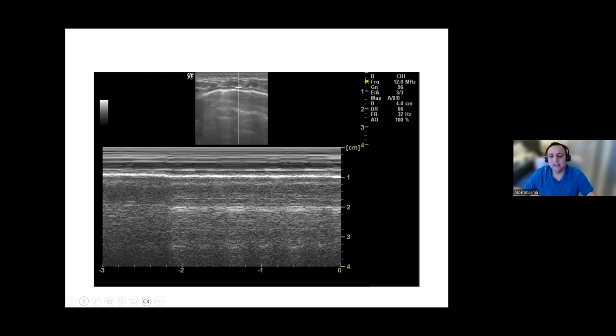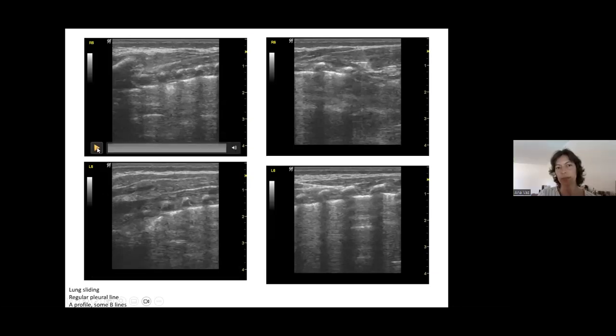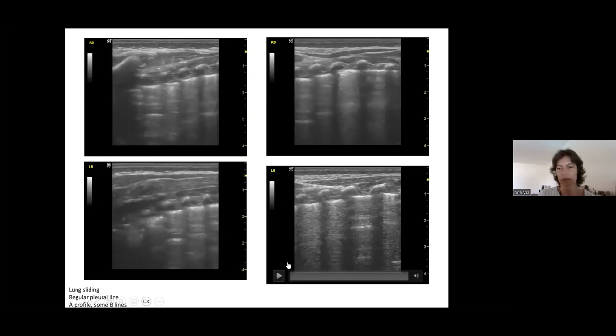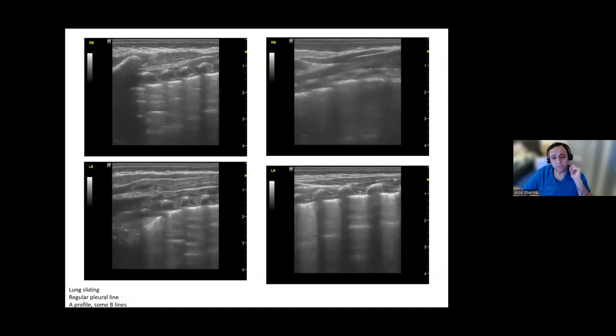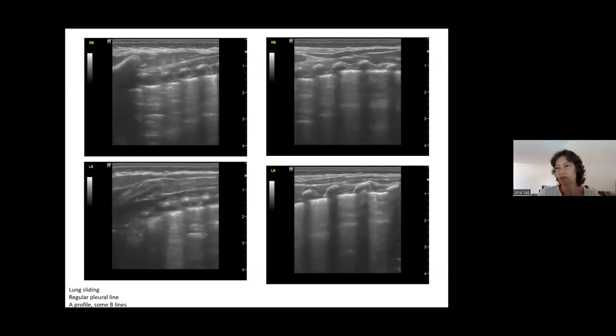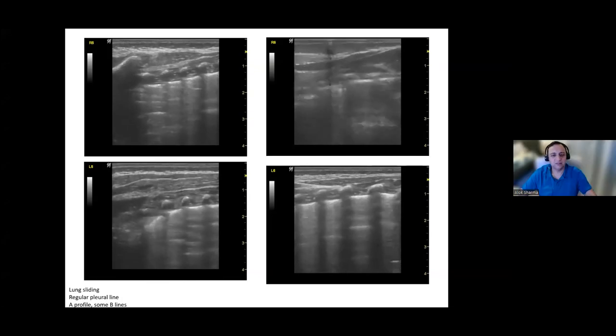I think if the baby ever became symptomatic again with respiratory distress, you'd repeat. But if the baby's clinically better and symptoms are improving, now he's good. Yes. I wouldn't worry about it. Yes, now he's good. And these were the posterior scans from yesterday that were okay. Very nice. Good depth. I just turned him in the moment, and no signs of pleural effusion in the back.